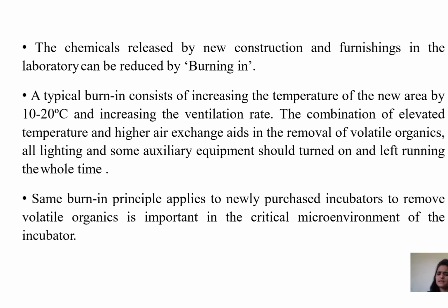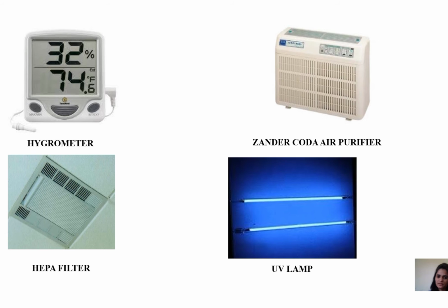Same burn-in principle applies to newly purchased incubators. To remove volatile organics is important in the critical microenvironment of the incubator. This is a hygrometer. It should always be there in the lab. Coda filters for air purifier, HEPA filters, the UV lamp. After each and every procedure, we should switch on the UV lamp for about 10 to 15 minutes.